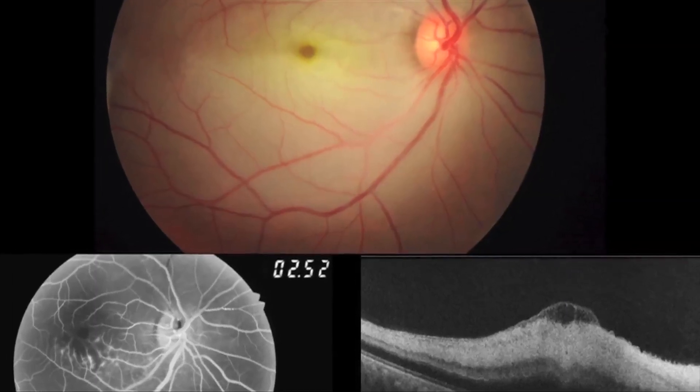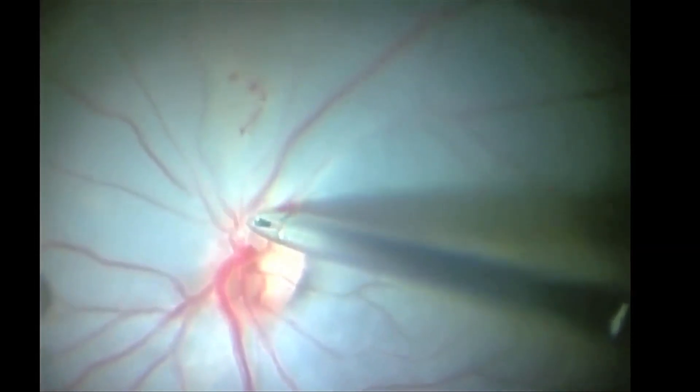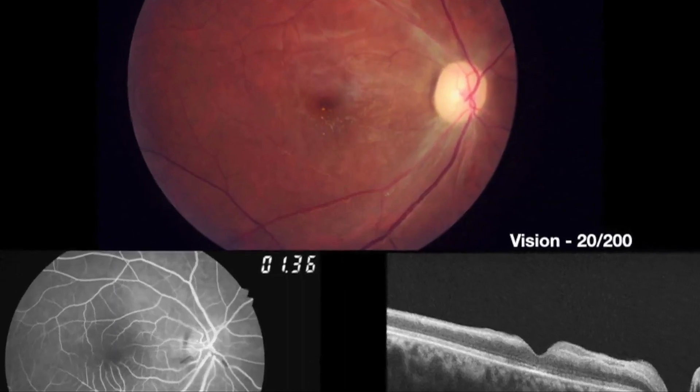In this 32-year-old gentleman with central retinal artery occlusion, the conventional treatment had failed. After performing the vitrectomy, one can see a part of the embolus being dislodged to the periphery. As the central retinal artery starts pulsating at the lamina, the rest of the embolus can be easily located and massaged out to the periphery. He went on to regain 20/200 vision.